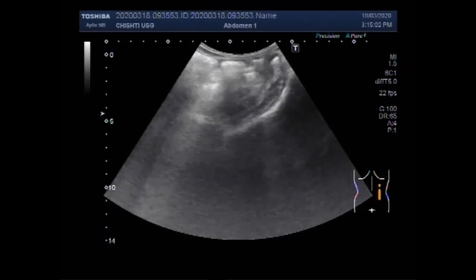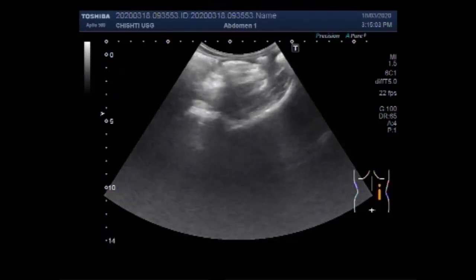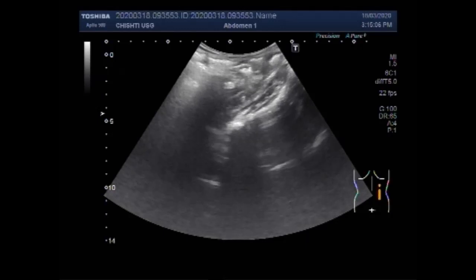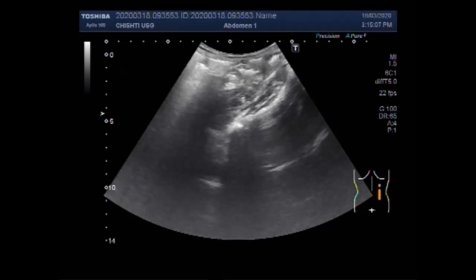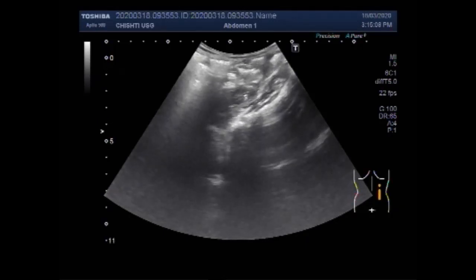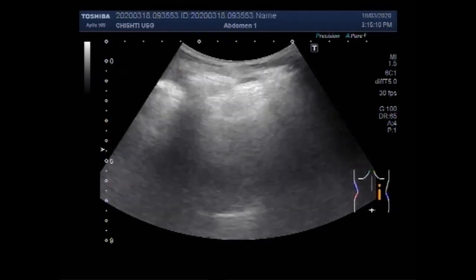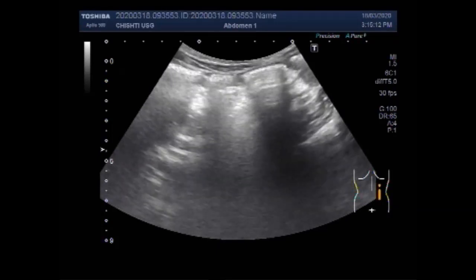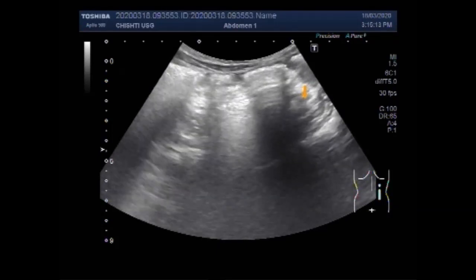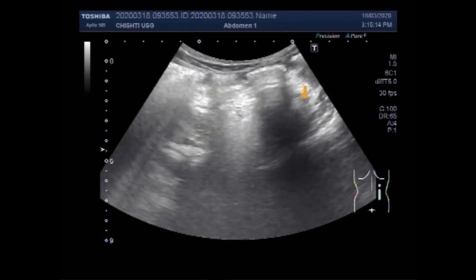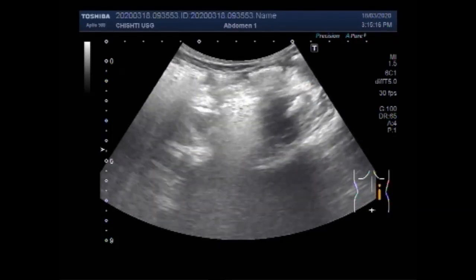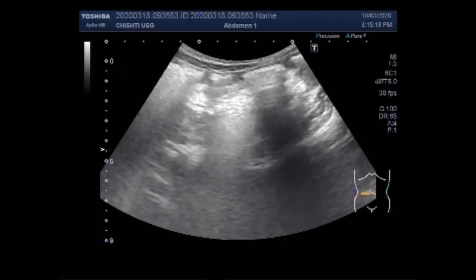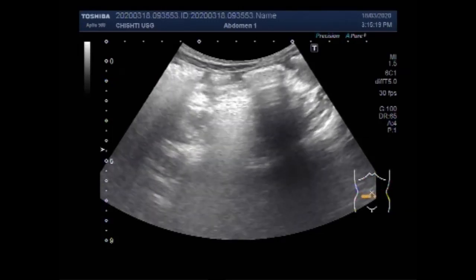Kidneys are known to shrink when there is damage that causes scarring of the kidney tissue. Infection, high blood pressure, diabetes, and certain types of glomerulonephritis are known causes of kidney shrinkage.